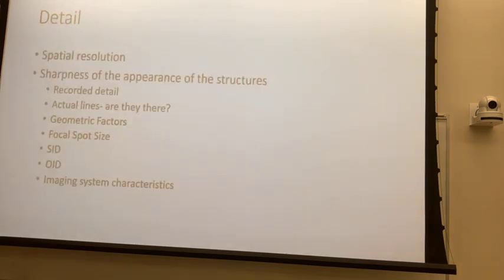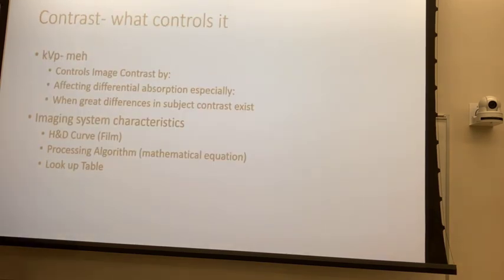when our exposure doesn't take a whole lot of exposure to go from low contrast to high contrast, then what we have is an H&D curve representative of a high contrast image receptor system. Okay? So you shoot a hand, you get it deep into your computer system where you can actually look at the lookup tables, and it's going to have an H&D curve that it assigns to a lookup table that is high contrast. So it's going to look like this. It's very straight. It goes from low density to high density with very little change in between.